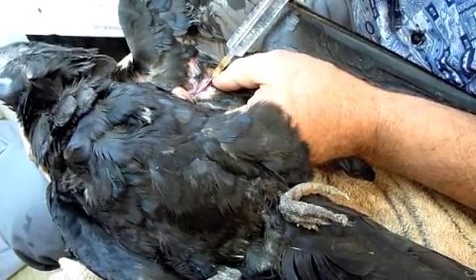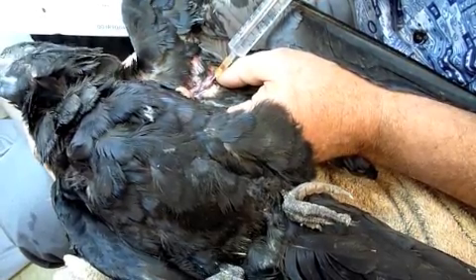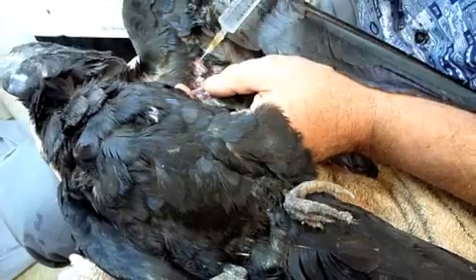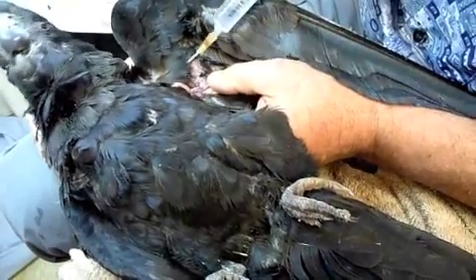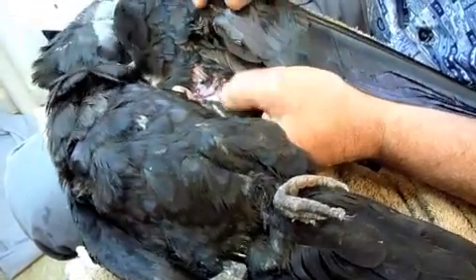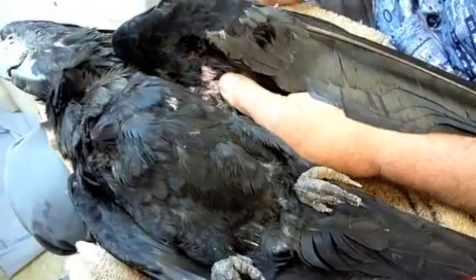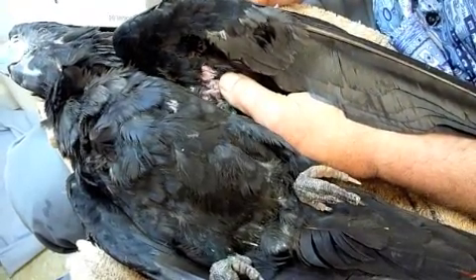That's not in. Not happy — that's not going in, that's not what we want. That is why we don't normally go to this vein as the first thing. I have to keep pressure on that to stop it developing into a big blood blister. I'll try once more.